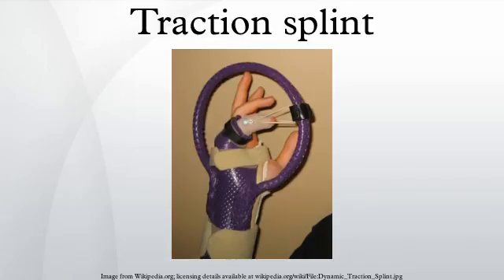Medical uses: traction splints are most commonly used for fractures of the femur. For these fractures they may reduce pain and decrease the amount of bleeding which occurs into the soft tissues of the leg. Some state that they are appropriate for middle tibia fractures which are displaced or bent. Others state they should not be used for lower leg fractures. Often a pillow splint or rigid splint is best in this situation.